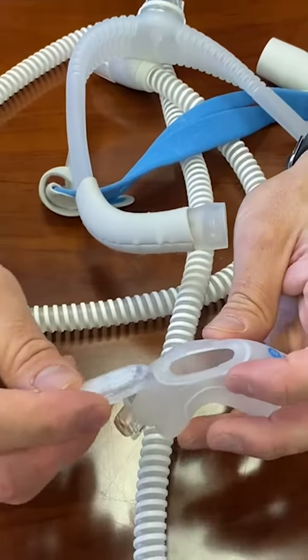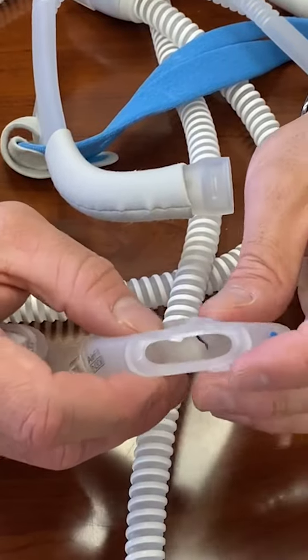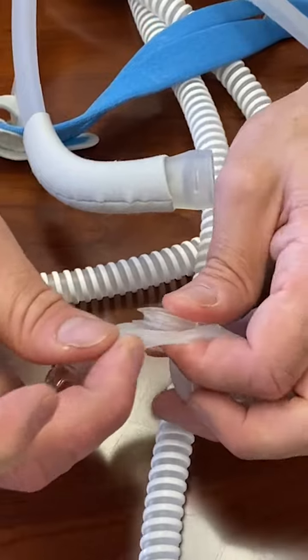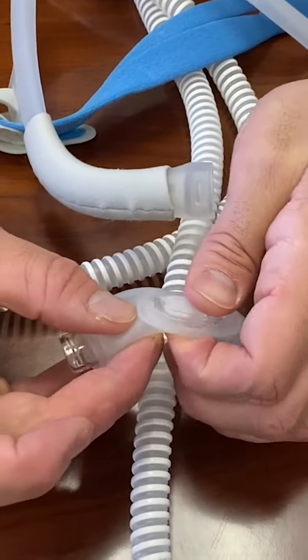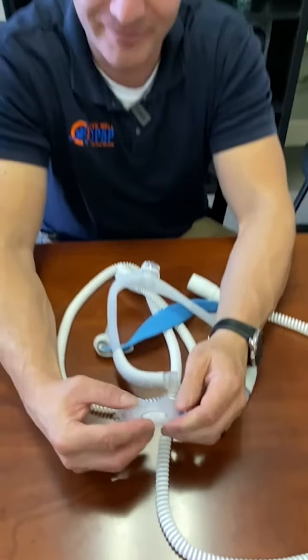You will have a couple of exhalation ports here. You won't feel the air coming out of this one very much because there's a diffuser in it, but up top you'll also feel a little bit of air coming out — there should be air coming out there. Those are where your CO2 is being vented off out of the system, because this is basically one big tube, so you want to vent it off on the top and the bottom.